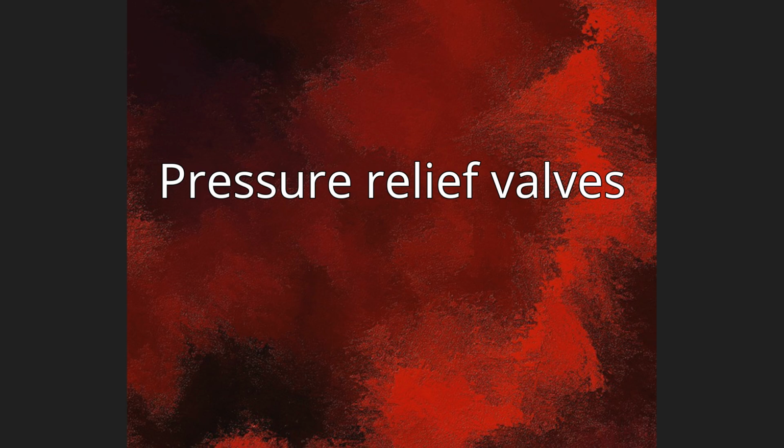Pressure relief valves. A pressure relief valve, often known as a pop-up valve, is typically included in pediatric versions and some adult versions, the purpose of which is to prevent accidental overpressurization of the lungs. A bypass clip is usually incorporated into this valve assembly in case medical needs call for inflation at a pressure beyond the normal cutoff of the pop-up valve.